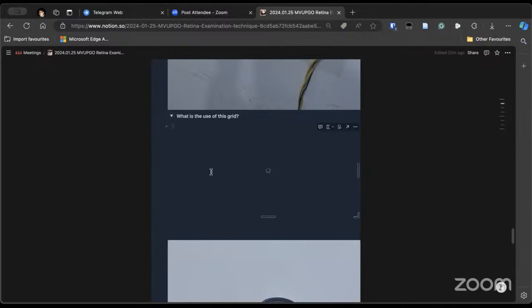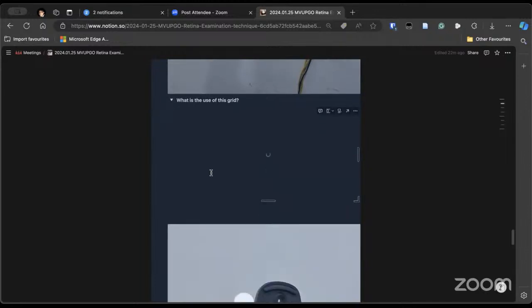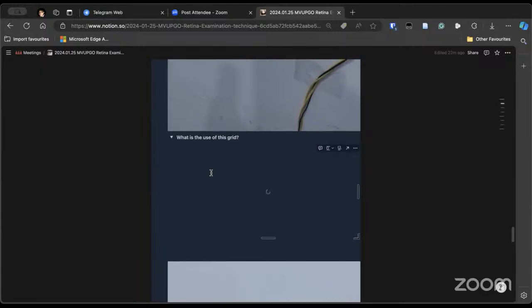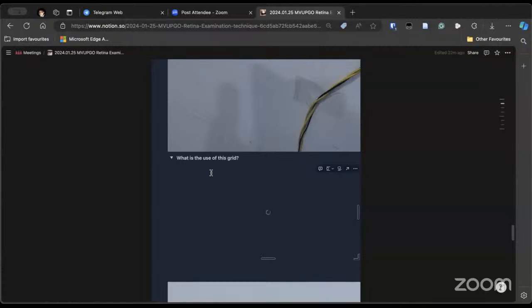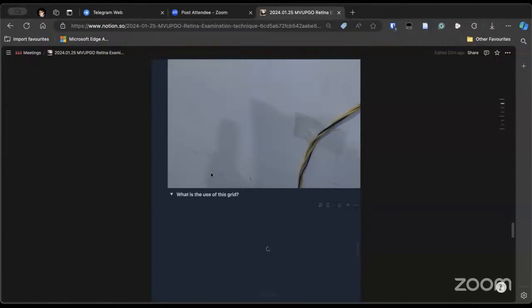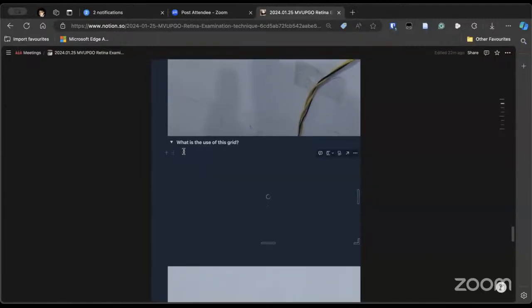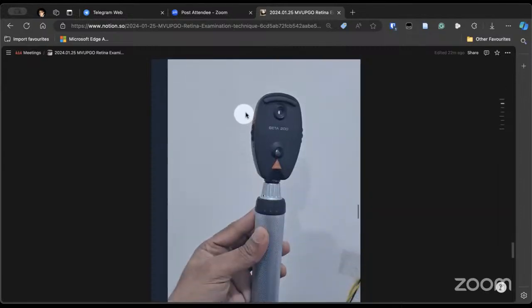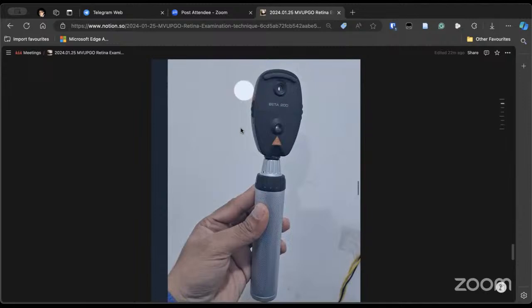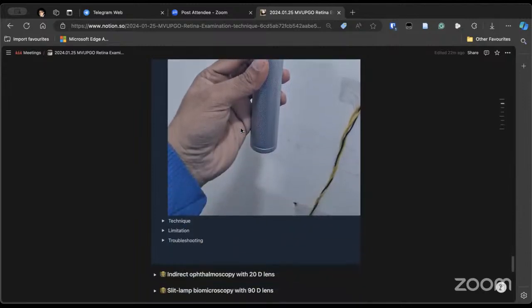So this is called the visuoscope. Read about this. This can be used to check for fixation, eccentric fixation, and also the distance of things from a reference point, or the meridian which they are in. And obviously you can change the color of the light, and also the size of the light.